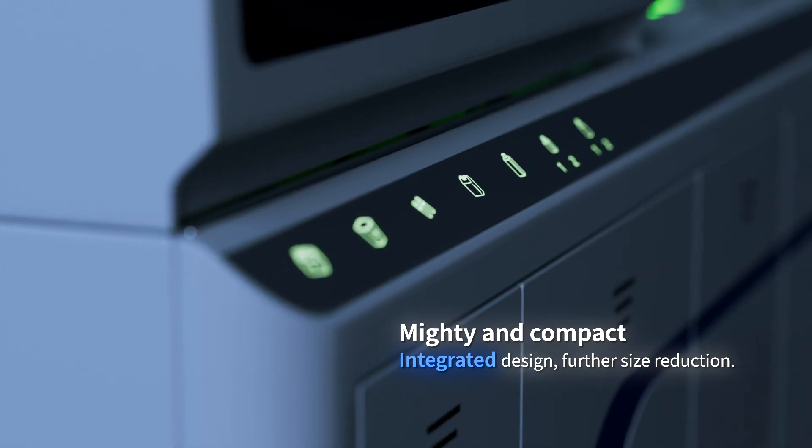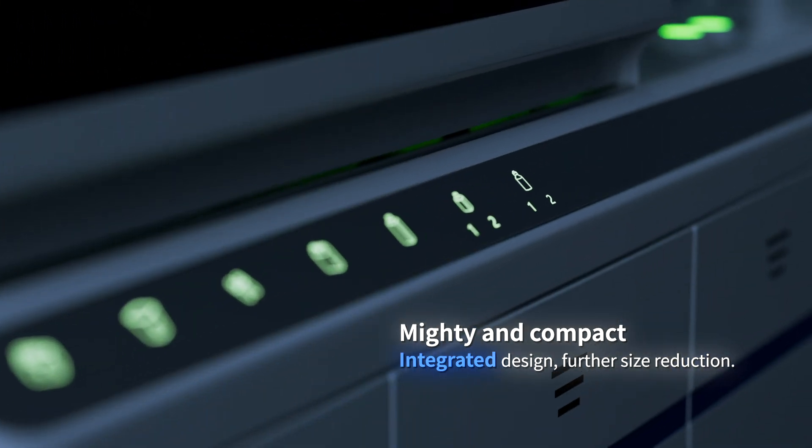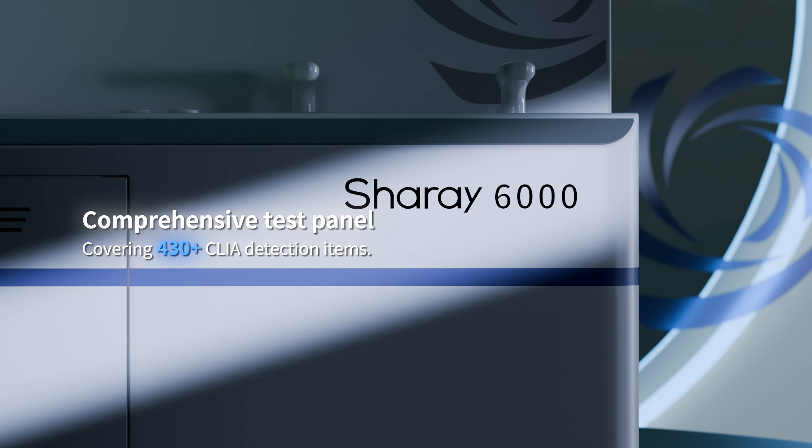Its integrated design contributes to further size reduction. Sharay 6000 enjoys a comprehensive test panel, covering over 430 CLIA detection items.